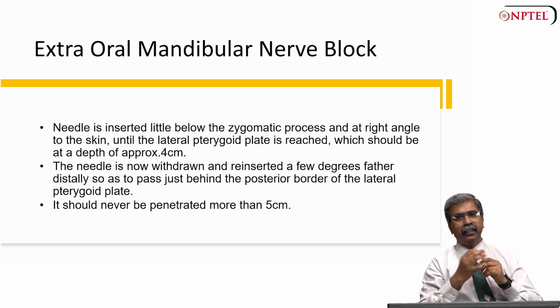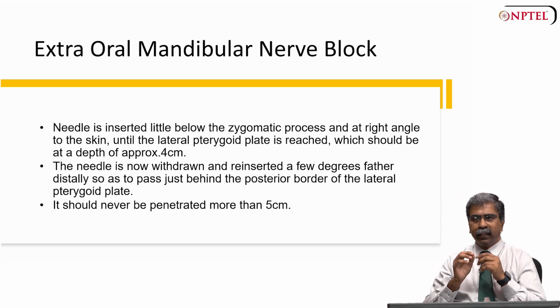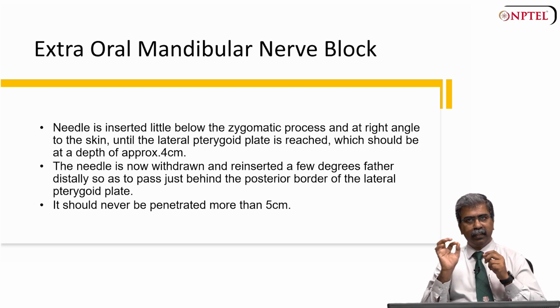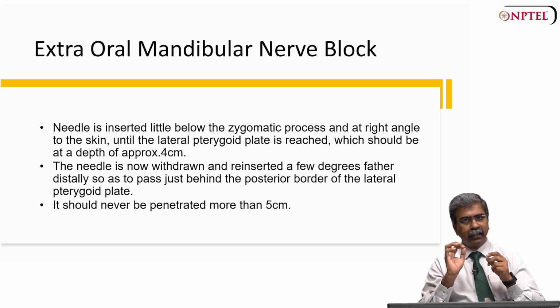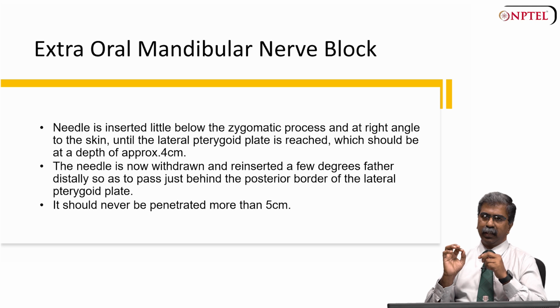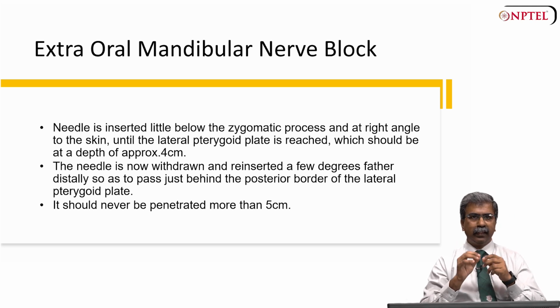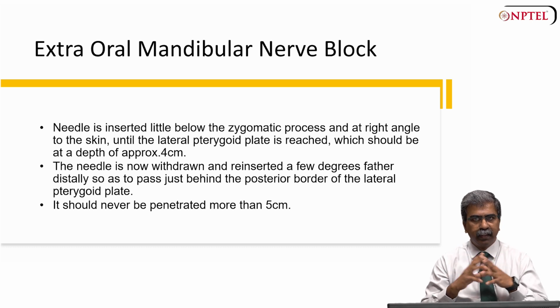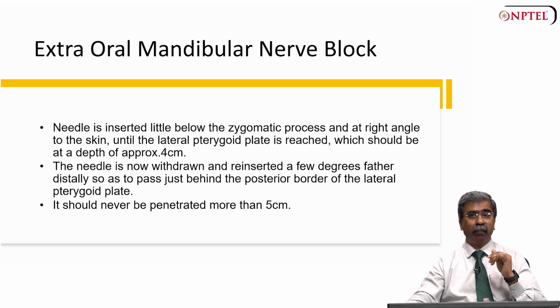After reaching the lateral pterygoid plate, the needle is withdrawn and reinserted a few degrees further distally to pass behind the posterior border of the lateral pterygoid plate. It is essential to ensure that the needle is not penetrated more than 5 centimeters, to prevent potential complications.